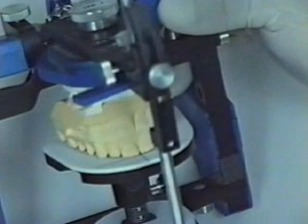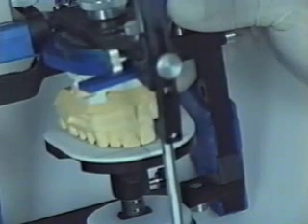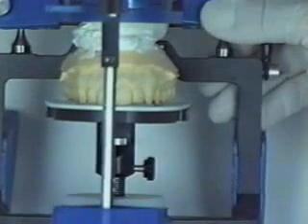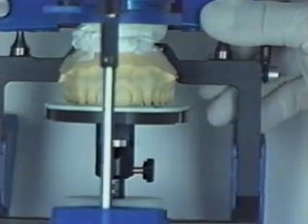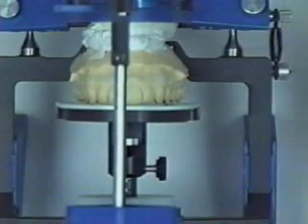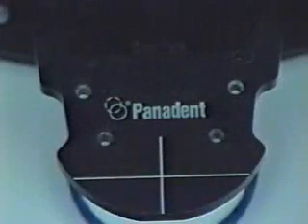For instance, in this particular patient, there is a slight alteration in the dental midline relative to the face. The maxillary occlusal plane is relatively level in the patient's face, and these are easily visualized with the use of the dental facial analyzer.